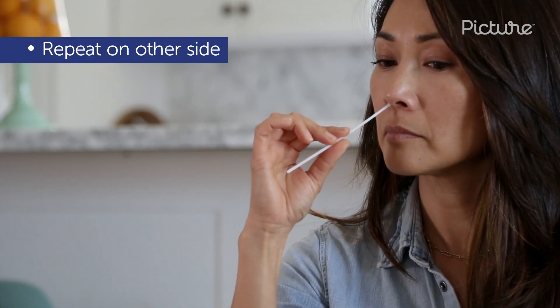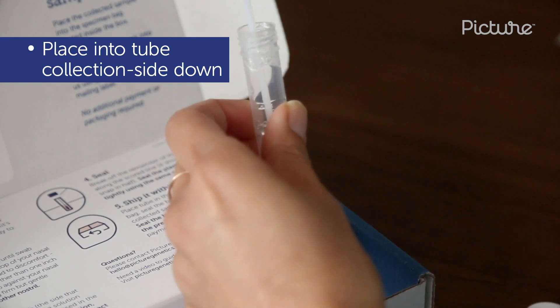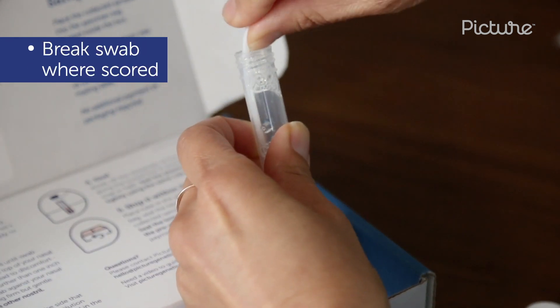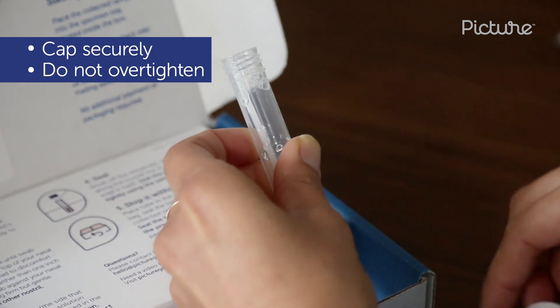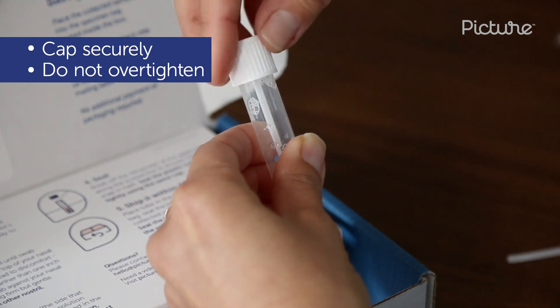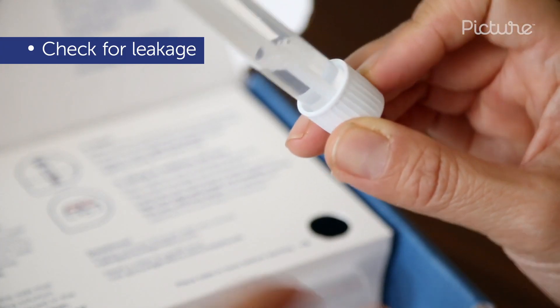Repeat in the other nostril using the same swab. Place the swab collection side down in the stabilizing solution tube. Break it off where it is scored — it should naturally snap in half. Make sure the swab is centered, then cap securely, but do not over tighten. Double check that there is no leakage.